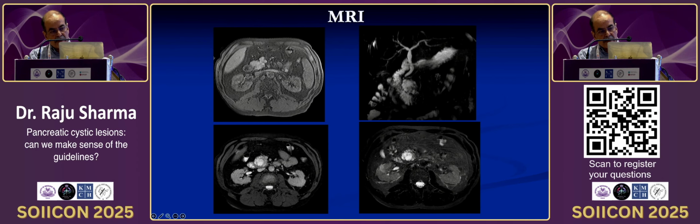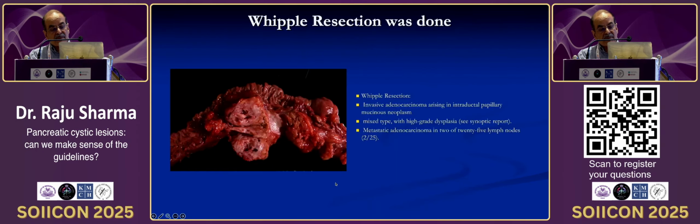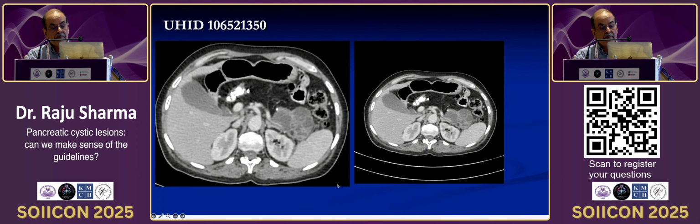This is an MR of the same patient showing you solid areas within that lesion in the head, and this patient was finally subjected to surgery and was found to have an invasive adenocarcinoma arising in a background of IPMN.